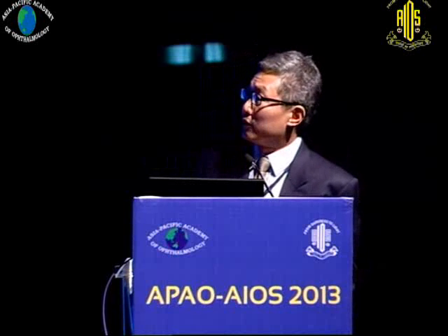And here's another one that seems to show, well, we're talking about natural history here. Maybe some of them do resolve spontaneously. This one sort of had an epiretinal membrane with some schisis, which got better by itself over a period of time. So not all of them will progress.